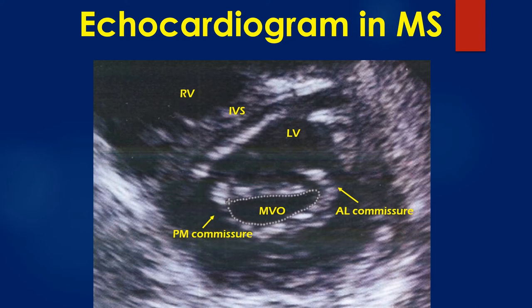An echocardiogram in mitral stenosis showing commissural fusion. The parasternal short axis view shows the mitral valve in cross section with the anterolateral and posteromedial commissures. The valve leaflets are thickened and the commissures are fused. The cut is slightly oblique, as a good cut should appear circular. It is often difficult to get a good circular outline of the mitral valve due to varying anatomical features of the chambers and cardiac position.